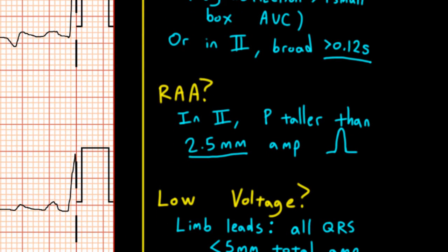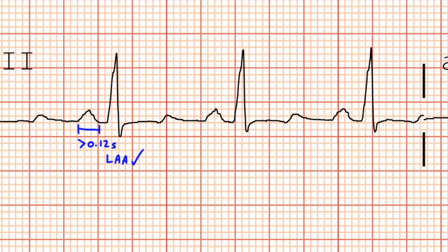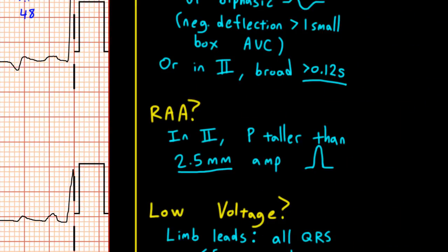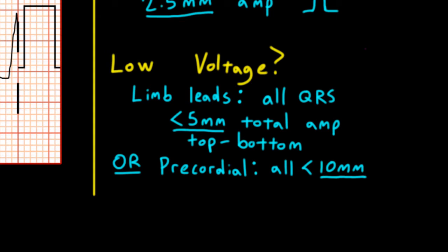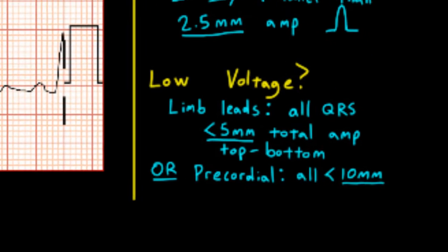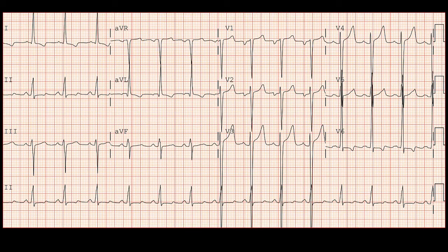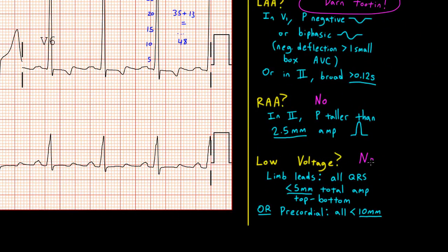Now let's look at right atrial abnormality. For right atrial abnormality, we look in lead 2 for a P-wave that's taller than 2.5 millimeters. Looking here in lead 2, this P-wave is not taller than 2.5 millimeters, so we don't have right atrial abnormality. Now finally, let's scan for signs of low voltage. We scan the limb leads for QRS complexes smaller than 5 mm from top to bottom, and the precordial leads for complexes smaller than 10 mm from top to bottom. Looking at both sets of leads, we have a ton of voltage here due to the patient's LVH — so we don't meet criteria for low voltage.